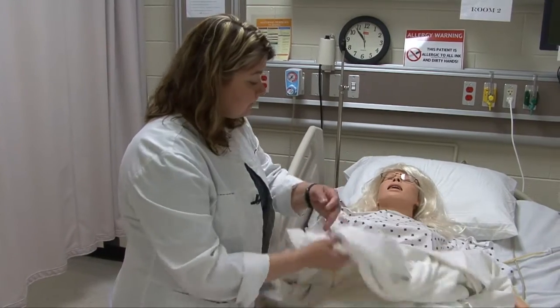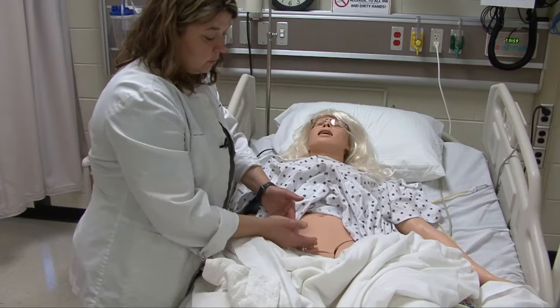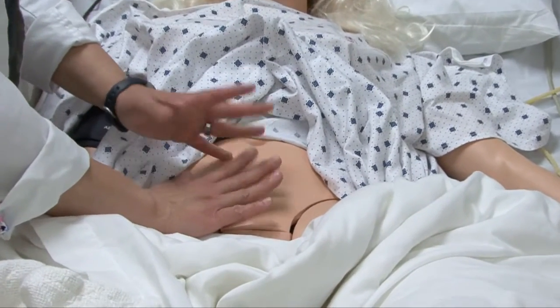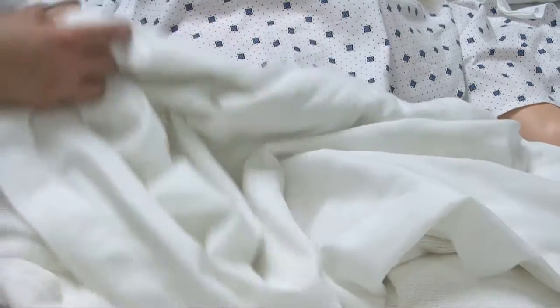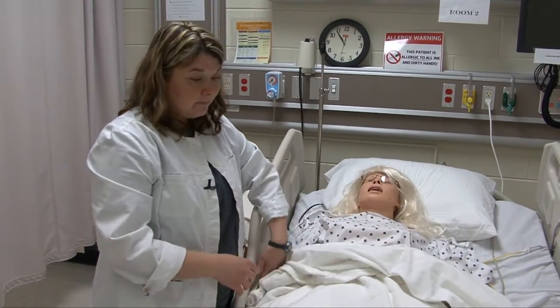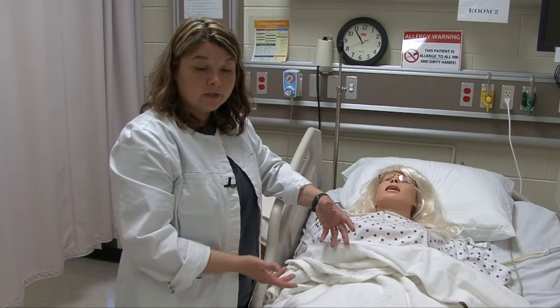To assess for urinary retention, I can uncover the patient's lower abdomen — right above the symphysis pubis — and palpate. If you can palpate the bladder, that is an abnormal finding and suggests urinary retention. You can also perform a bladder scan to see how much urine is present. Keep track of the color, odor, consistency, and amount of urine output. Generally, encourage her to drink fluids to stimulate urination, unless there are fluid restrictions.